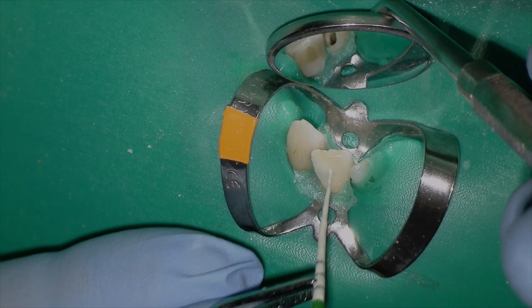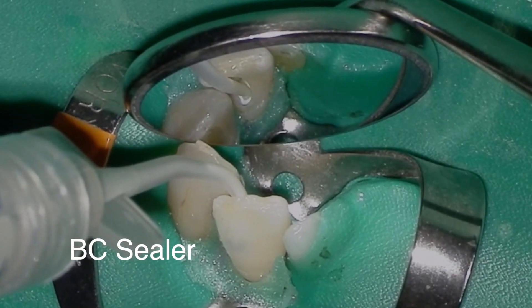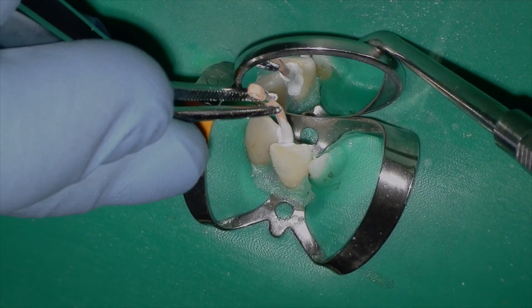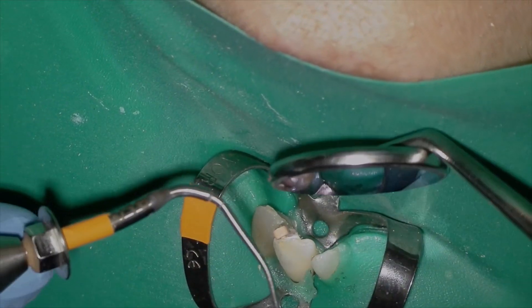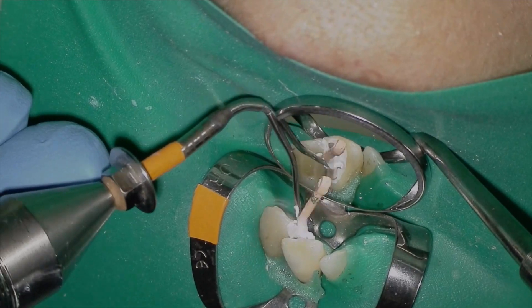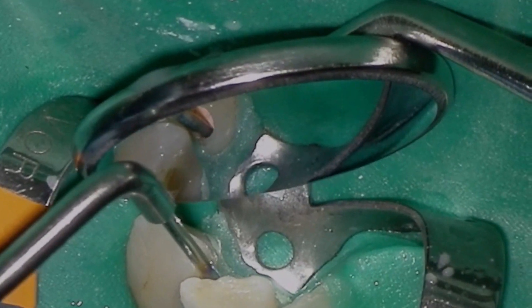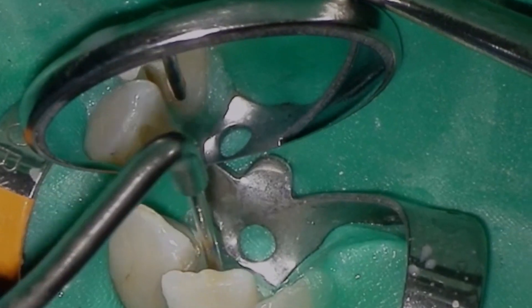We're going to dry with our paper points. We're going to place our BC sealer in the coronal half of the tooth, place our gutta-percha point, pump it a couple of times, and take a working length radiograph. We're going to sear the coronal portion of the gutta-percha, pack it down, burnish the gutta-percha into the walls of the canal, and plan to start restoring it.